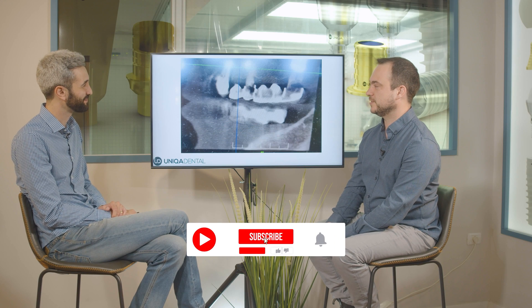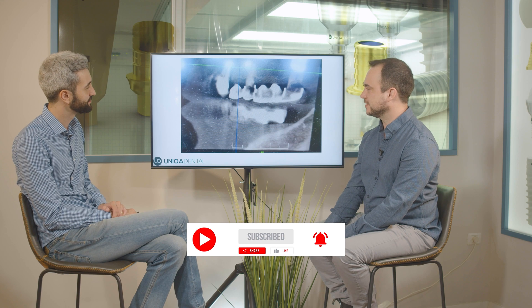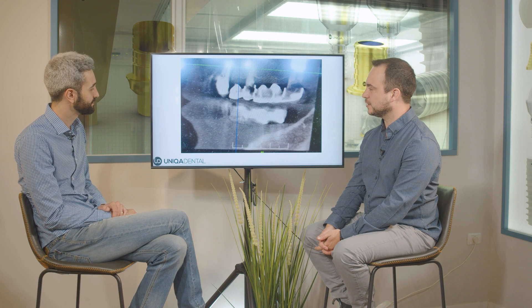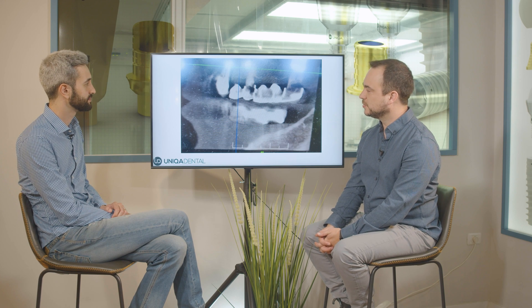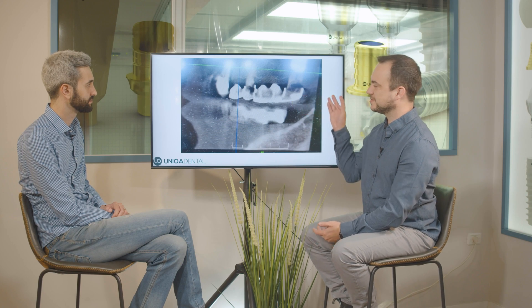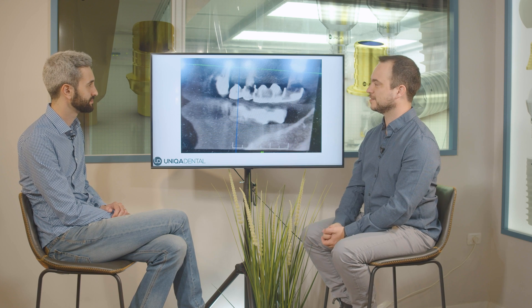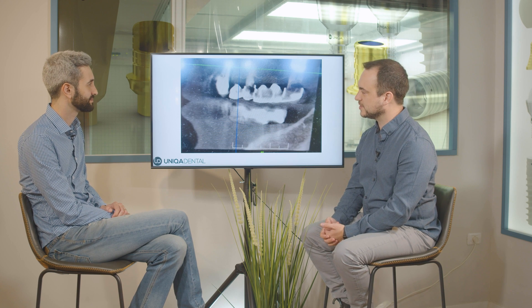Today we have a case where, as you can see in this x-ray and CT, the patient had a metal bridge on two teeth. The teeth had extensive caries and extraction was needed without question — you can see that from the teeth almost nothing is left. You could just take out the bridge with two fingers, and in this case you need some kind of restoration.